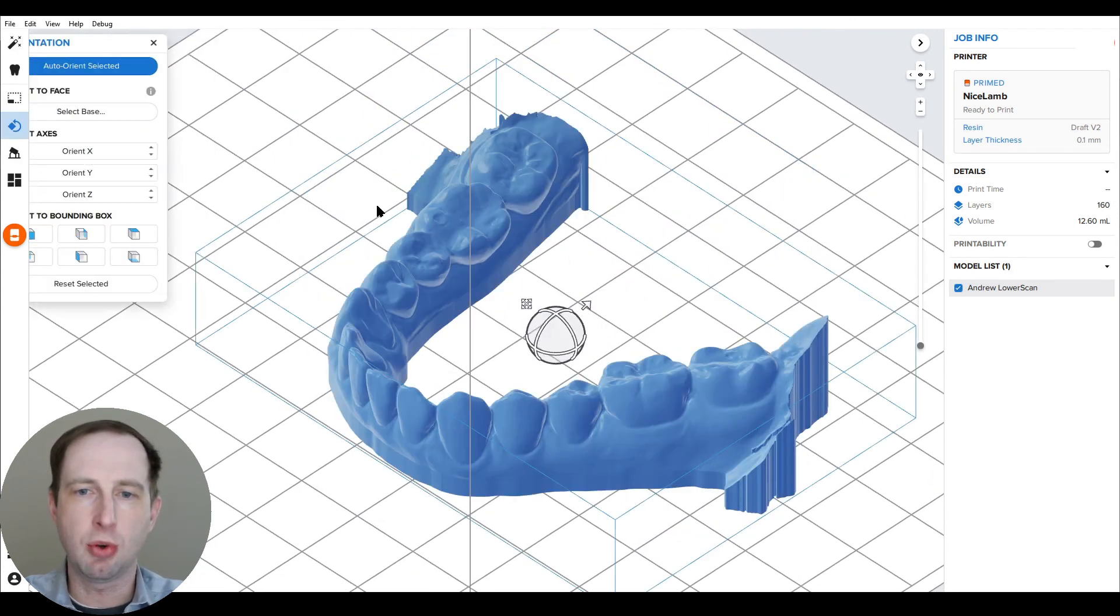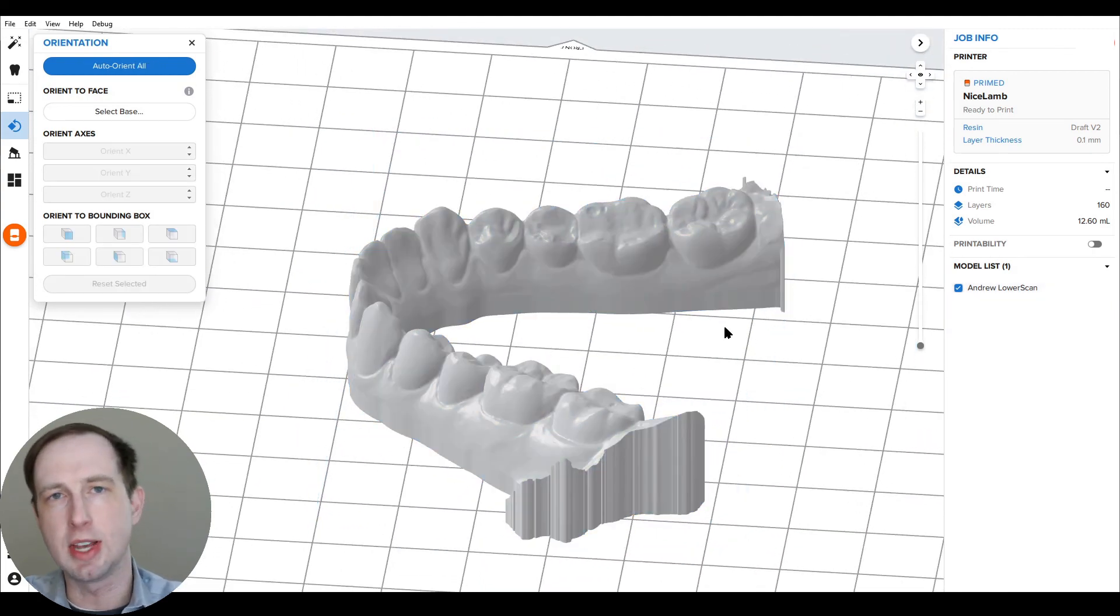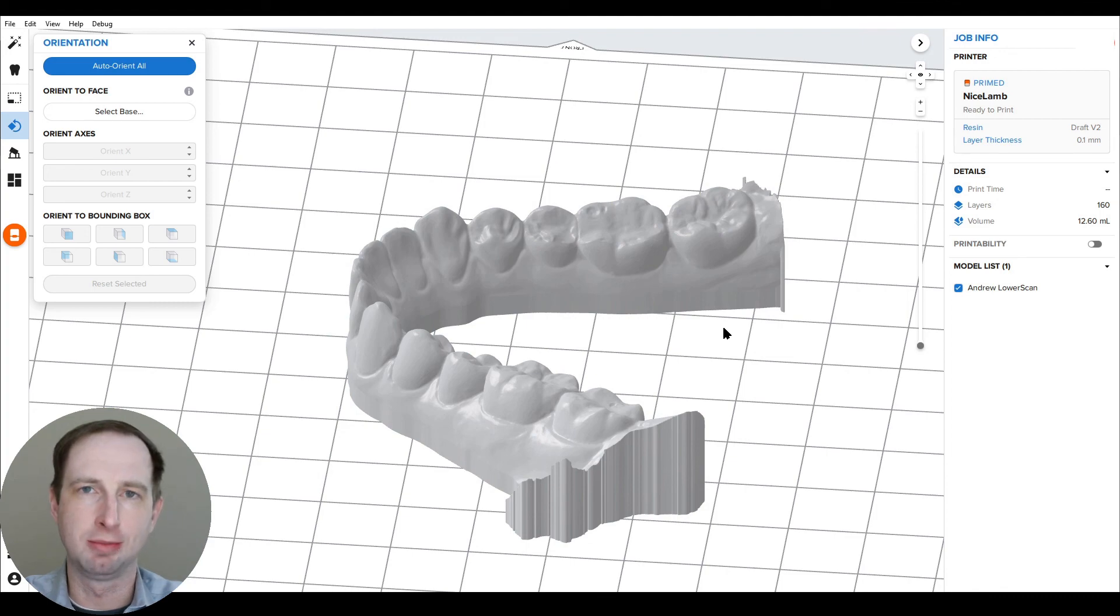So that does it for this walkthrough on Scan to Model. I hope you enjoyed it. My name is Sam. Thank you very much.